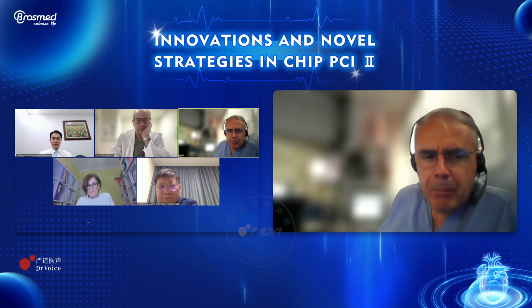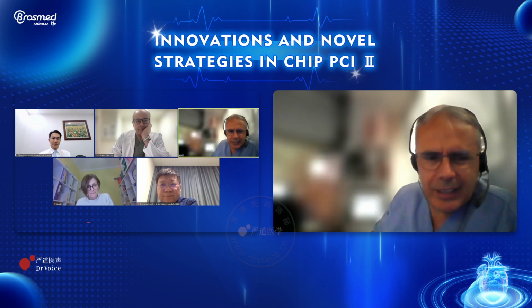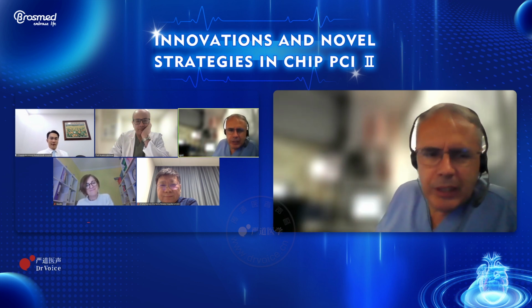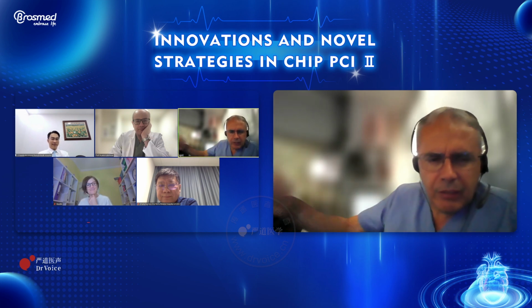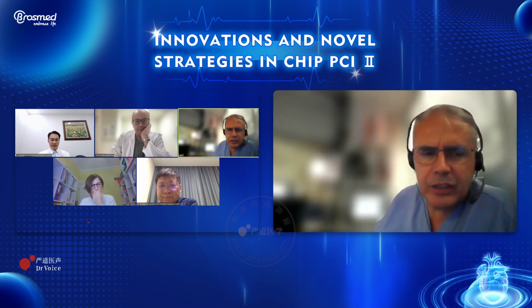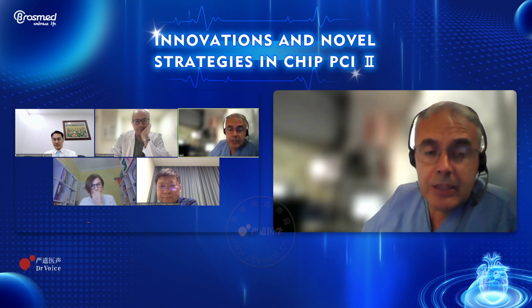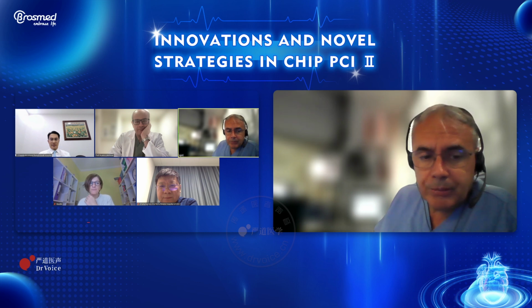Okay, we need to learn from a lot of cases to understand well the action. Probably the impact on the plaque is more similar to scoring than cutting, but we need evidence in a lot of cases in different types of lesion: calcified, fibrocalcified, very highly calcified lesions. And also in-stent restenosis, which I think is another important thing.